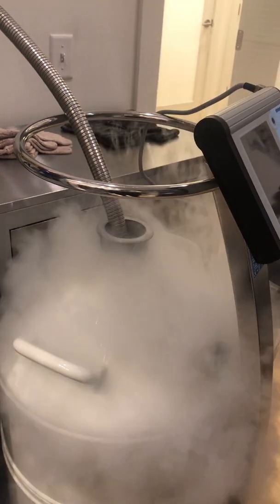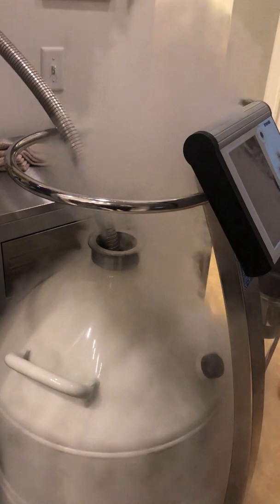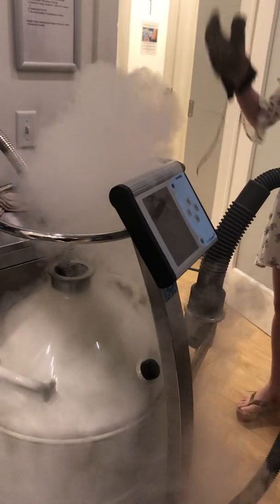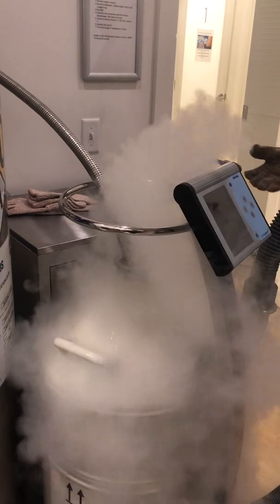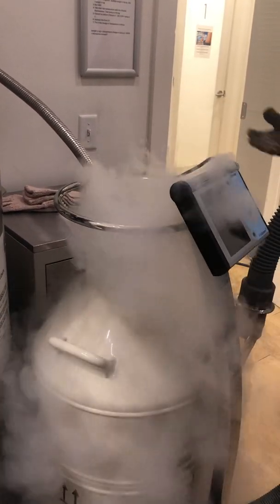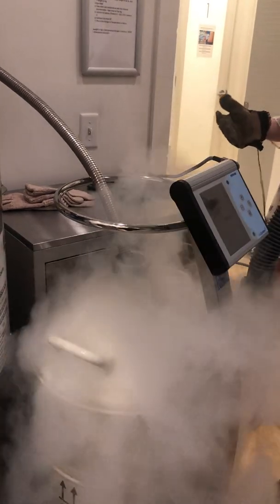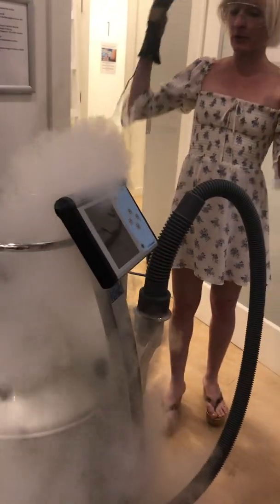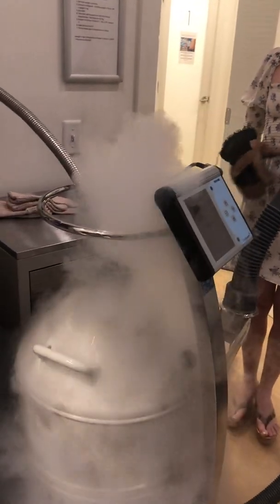Sometimes it gets a little exciting. You just want to make sure that you're far enough away from the dewar, so if it does rise up in a little bit of an eruption volcanic effect, that you're not standing close to it. And never under any circumstances should you look into the dewar, just because at any point liquid nitrogen may spew out the top, and you just don't want to be in the line of that fire.